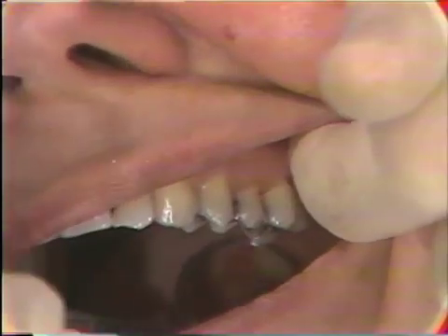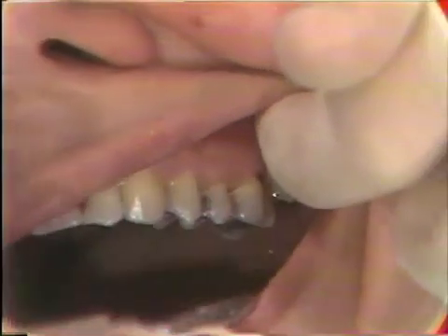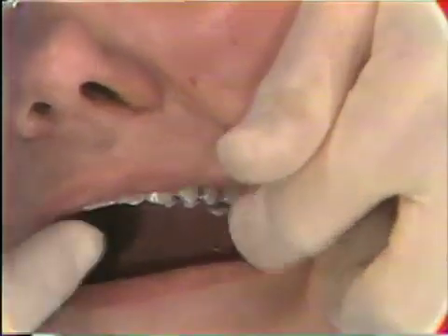When placing a dressing, it's always advisable not to use more material than necessary, so the area is examined to determine how much will be necessary. Darlene is told to mix ten drops of material, so she'll place the powder on the mixing pad.